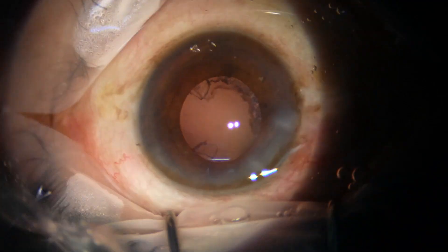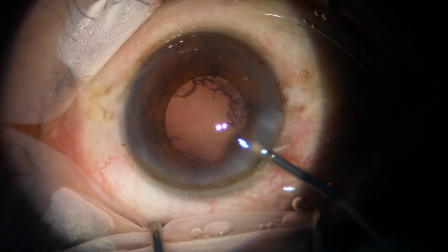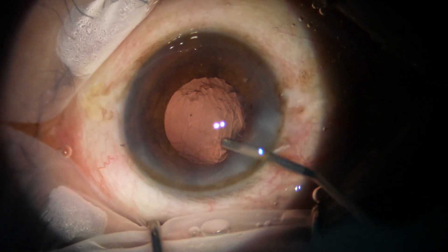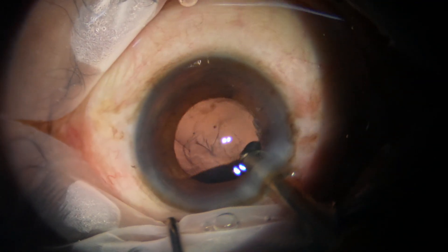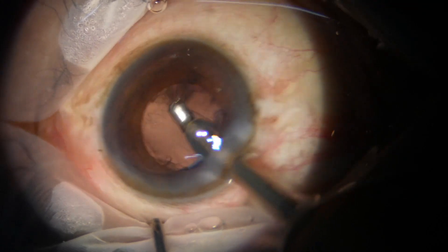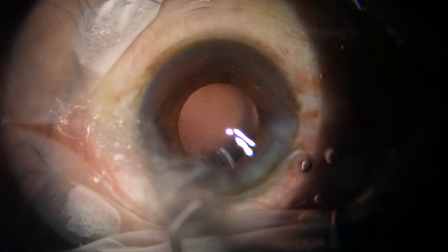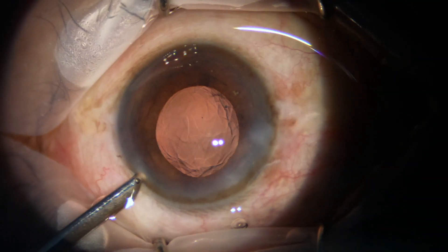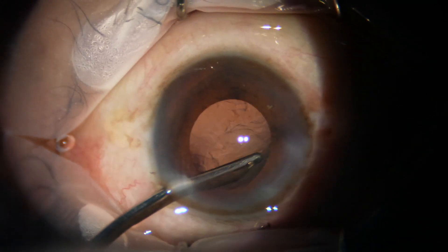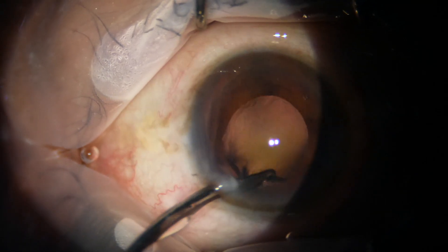This is the cortex. Part of the cortex at 3 o'clock has been removed by the handpiece itself. Now I inject visco and use coaxial irrigation aspiration to remove the cortex from 5 o'clock to 10 o'clock. I find it difficult to remove the sub-incisional cortex with this instrument because the pupil has calmed down a bit at this time.